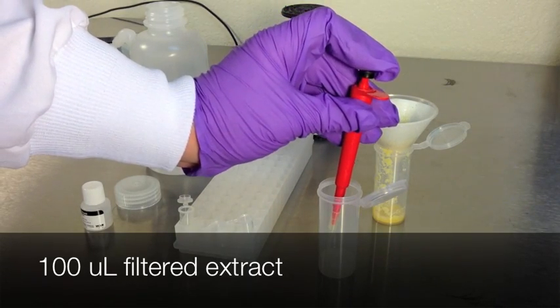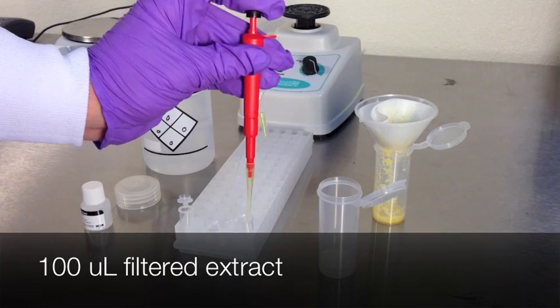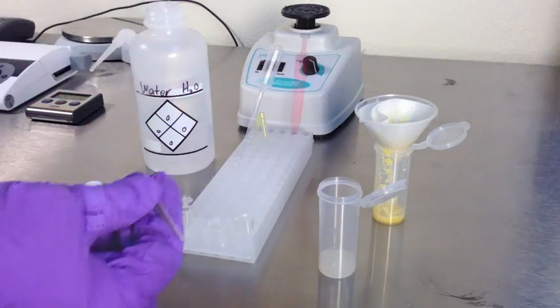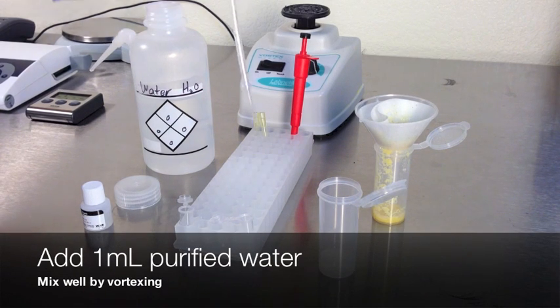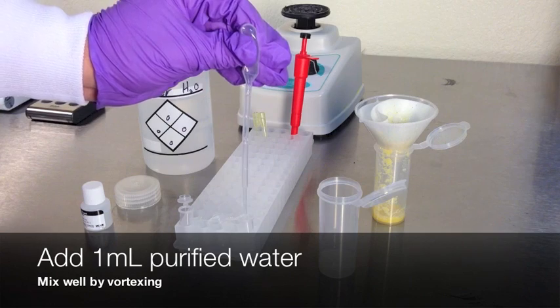Transfer 100 microliters of filtered extract to a new disposable strip test vial. Add 1 milliliter of purified water and mix well by vortexing.